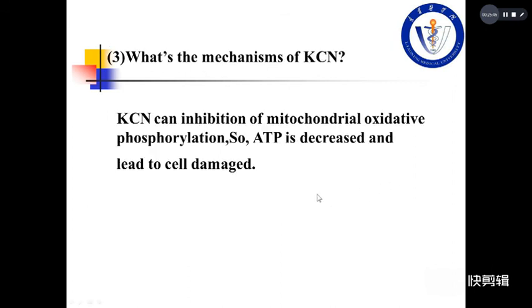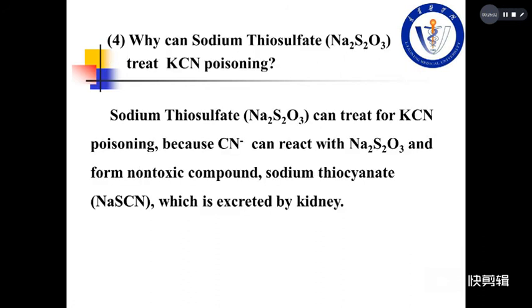Now, because oxygen utilization decreases, tissue cells take in less oxygen, so in tissue capillary blood oxygen will be more, so the color is rosy, like arterial blood.